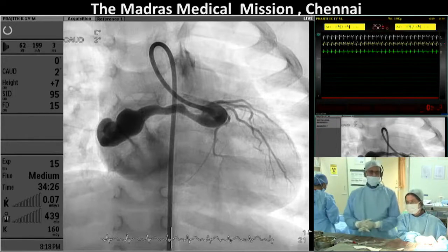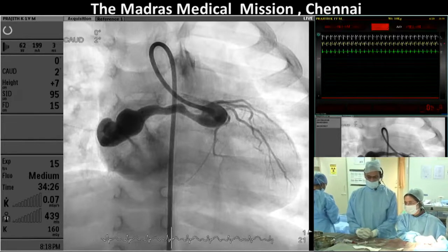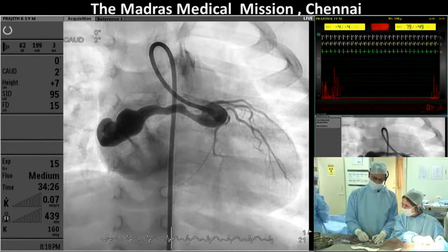Is there a surgeon in the audience? Bulos or Hakan? No, they're not here. But what are you going to say? Jim, I'll come back to my concern: if you float a coil, it will go into that pouch, but I don't think that it will find that exit to block the fistula.